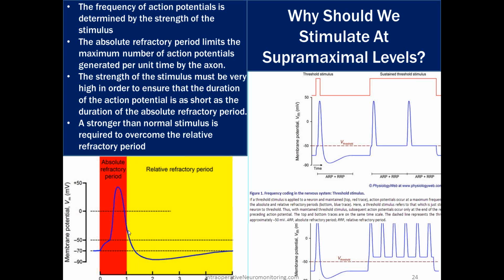And this is kind of a generalized picture here. But when we think of our inter-stimulus interval that we use for motor evoked potentials, the literature states that 2 to 4 milliseconds, dependent upon the intensity used, as well as other things like the impedance of the potential or the electrical stimulation itself, is the sweet spot for having a multi-pulsed MEP.